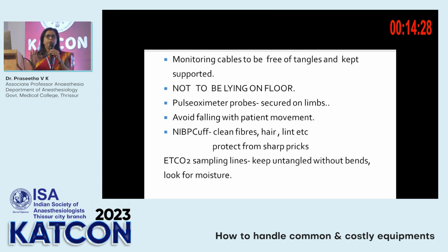So whenever you are using a pulse oximeter probe, attach it to the limb of the patient so that it does not fall down each time with patient movement.